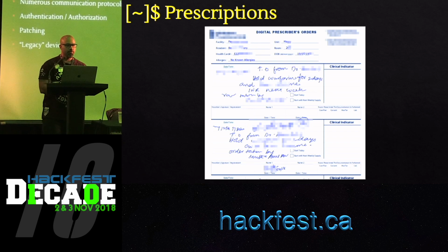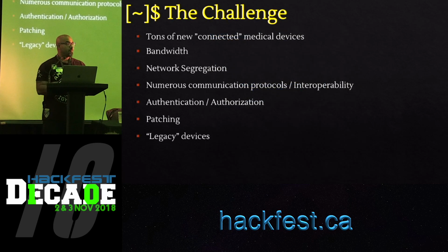And one of the challenges for the medical institutions going forward would be that there will be tons of medical devices, and they need to make sure that they would have enough bandwidth to support all these medical devices. They would also need to make sure that there's enough segregation. Because there are going to be so many medical devices, how do you segregate the network?